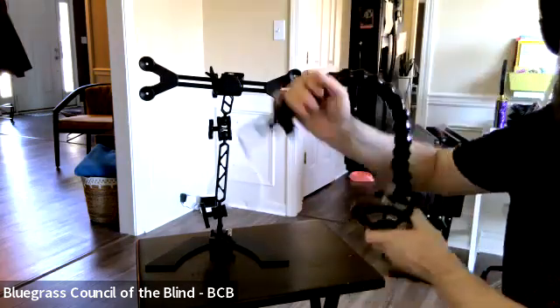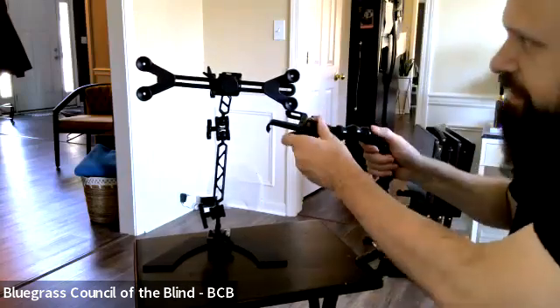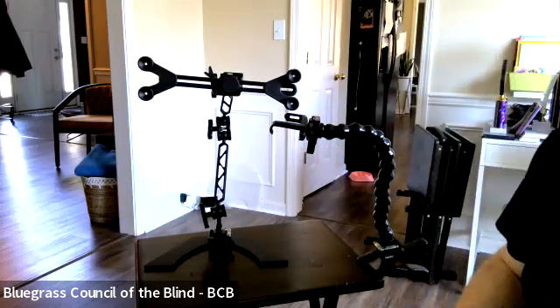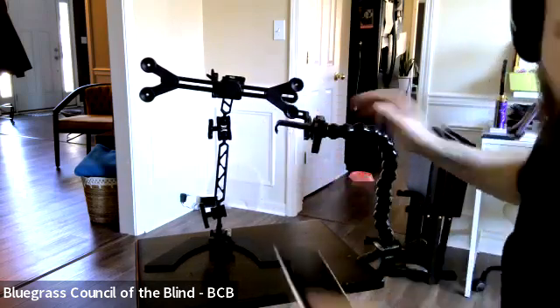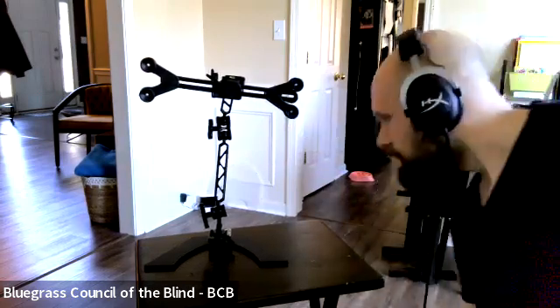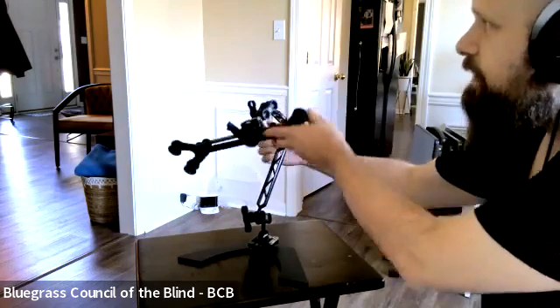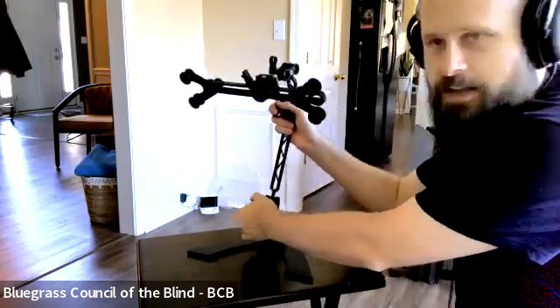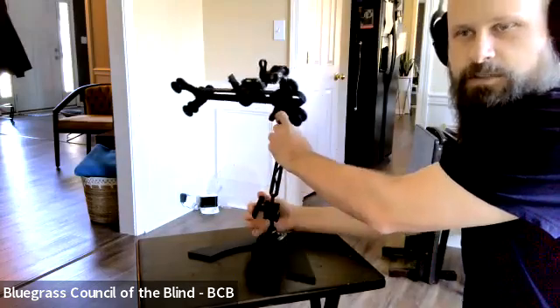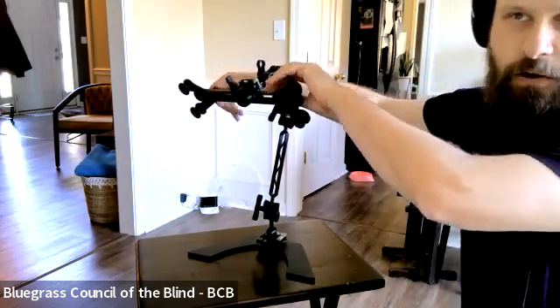Because they're so flexible, you can move them in whatever position you want. This particular one will clamp onto the edge of a table, and then you can put your smartphone in there and have it pointed down at the table. That's always an option. This one here is more rigid. It's actually made out of metal, but it's very adjustable. All the joints here are posable. You can adjust them whatever position you want. And then you have this large tablet holder here that is also adjustable and can hold basically any size tablet that you want.